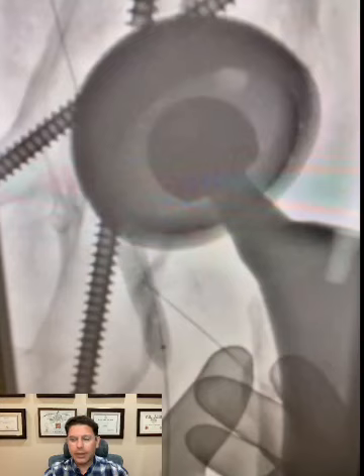And subsequently, of course, there was a need for iliac vein stenting, and of course this is not doable from a tibial vein access, so the common femoral vein needed to be accessed, but we found difficulties in getting access to this diseased vein, which was ballooned from the tibial vein access.